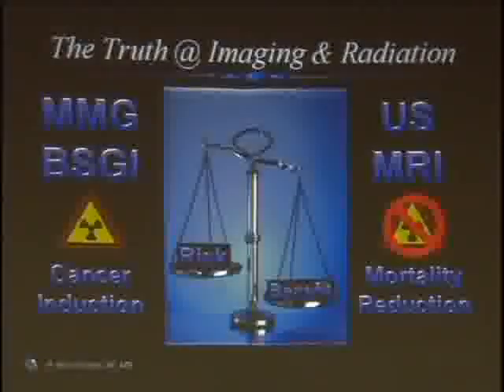It's indisputable that the radiation from a mammogram is worth it because it changes mortality in lots of people. Now, like I said, there is this one population that's evolving in the literature, BRCA patients, where the radiosensitivity of their breast may one day say, don't do mammograms in them anymore, but that's a very special patient, and we're not there yet.